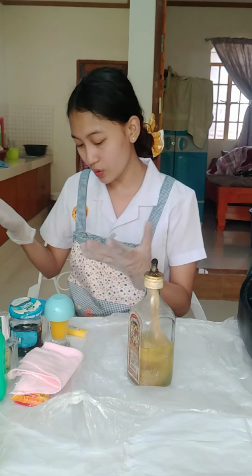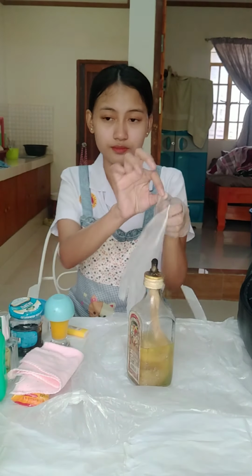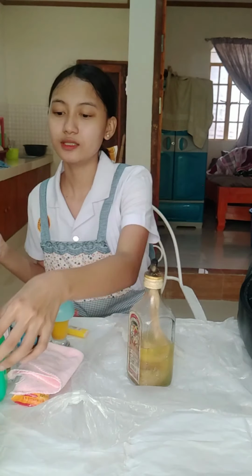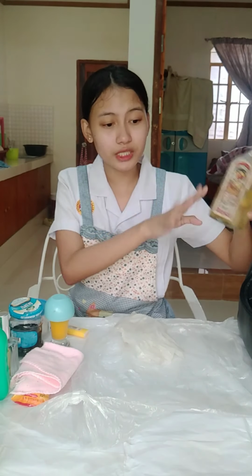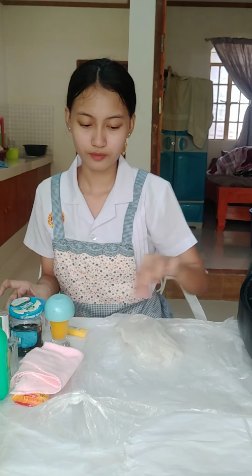And then after that, I'm going to wash and drain all the materials used and then discard them in the waste receptacle. So I'm going to remove my gloves. And then I'm going to wash my hands. So assuming that I've already finished washing my hands, I'm going to perform hand hygiene with alcohol to remove all the microorganisms. And then after that, I'm going to return all the equipment that I used. So assuming that I already put the alcohol lamp in my CHN bag, then I will put my gloves in the waste receptacle.